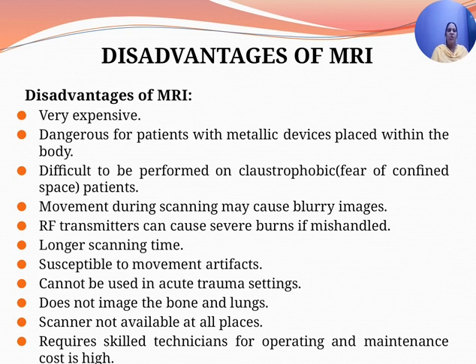It is dangerous to use this for patients with metallic devices placed within the body, and it is difficult to be performed on claustrophobic patients, that is patients who have the fear of confined, very narrow spaces. You are pushing the patient into a narrow gantry, so it is difficult to be performed on claustrophobic patients.